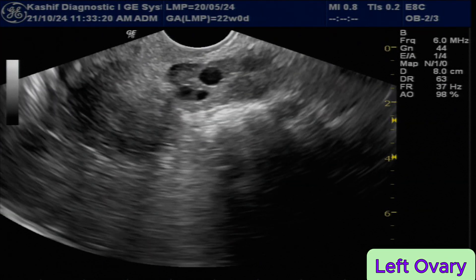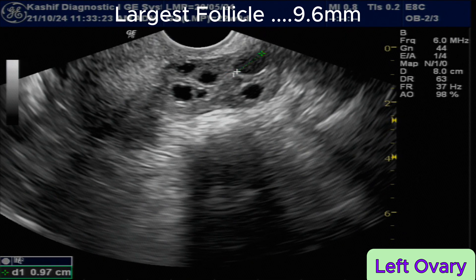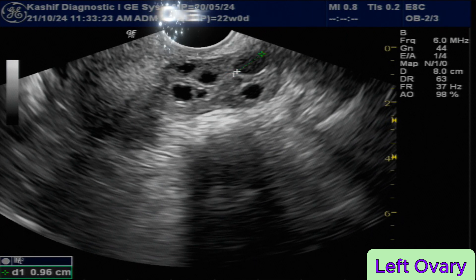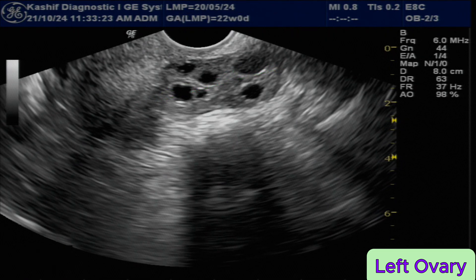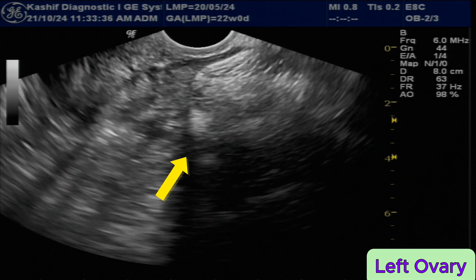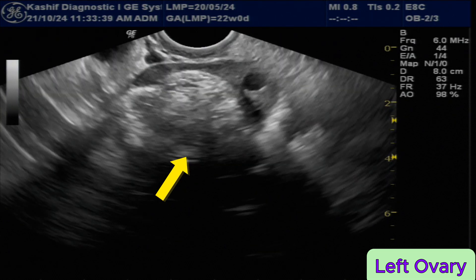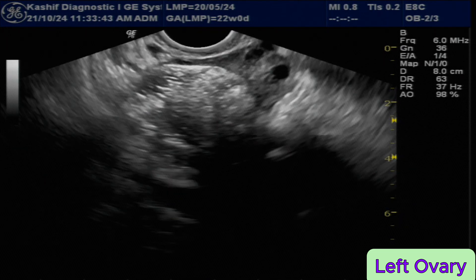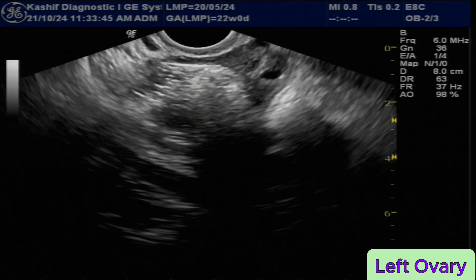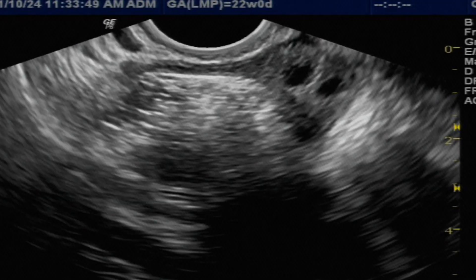This is the left ovary. Again, we see multiple small follicles in the left ovary, with the largest measuring 9.6 mm. There is an echogenic mass in the left ovary measuring 46 mm. It is highly echogenic, has smooth margins, and is avascular, with some internal areas of mixed echogenicity and fine thin echogenic strands.